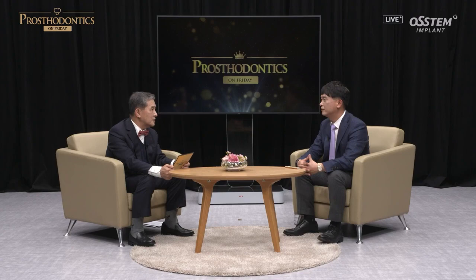Don't be obsessed with one thing. There's no correct answer. I want to say this again. I'm not saying this is the correct answer. This is one of the options. So this is one more available option that you can use. I believe there are many options because there are many such cases where fixed prosthesis is very challenging for implants. In that case, fixed removable can be a very good option.